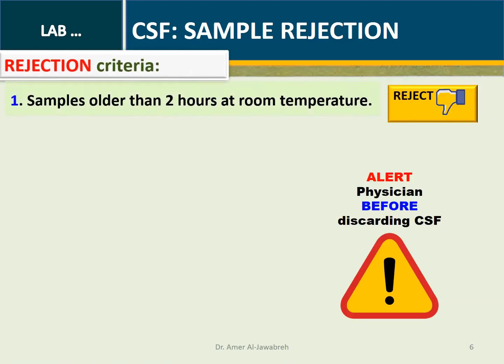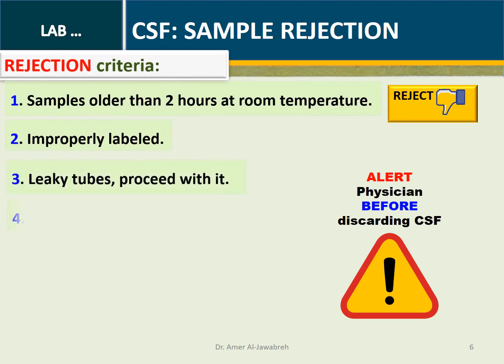CSF sample rejection. A CSF sample can be rejected in any of the following. However, alert the physician before discarding.